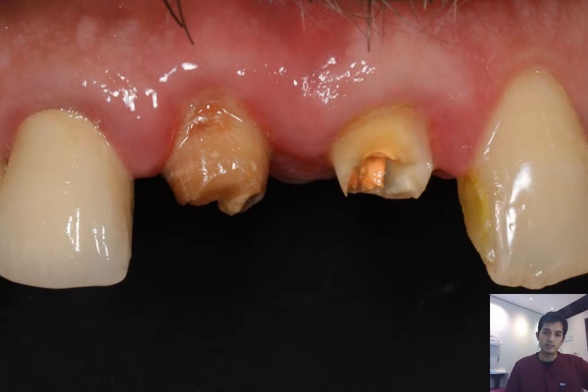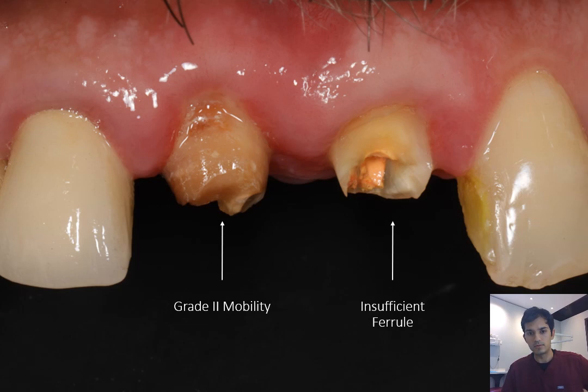It also happened that tooth number 1-1, the other central incisor, you can see how dark it is here. This presented with grade 2 mobility, and now that the patient was without his splinted crowns, we could assess them individually. And this had a periapical lesion combined with a periodontal lesion that was causing this mobility. So very poor prognosis on both of his two teeth. And we opted to replace them with dental implants instead of trying to salvage these ones here.